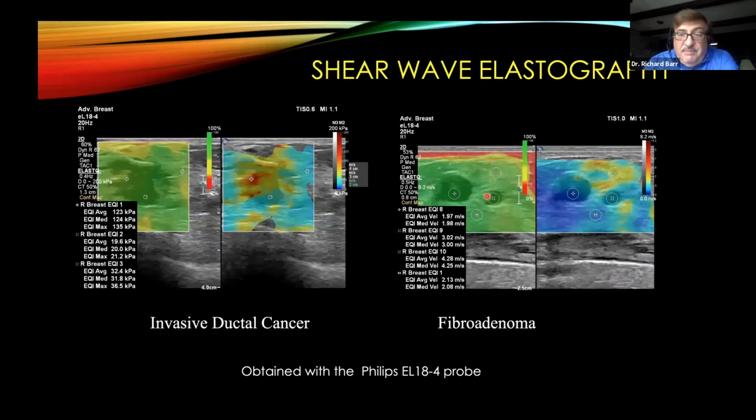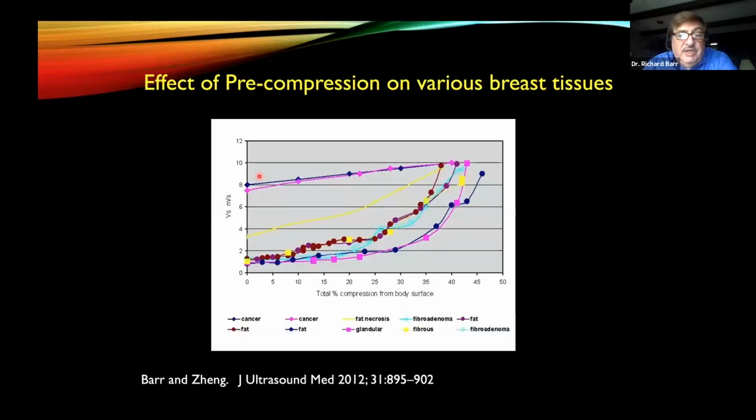And here are some examples. On the right, we have benign lesions that are fibroadenomas. Again, you can see the velocity map. The lesions are pretty uniform. Our quality map is green. It's very good. We've got some areas of bad data near the top. But here in this invasive ductal cancer, notice that there are areas that are very soft and areas that are very stiff and others that are intermediate. And we interpret the shear wave by finding the stiffest area within the lesion or within an approximately 3 millimeter surrounding rim. And we'll talk about why that is shortly.